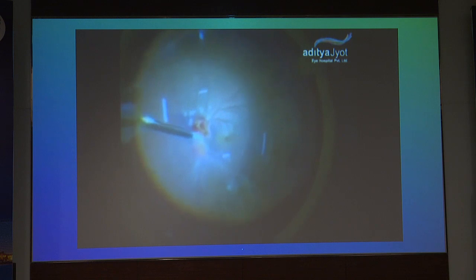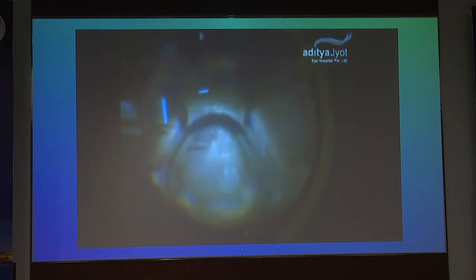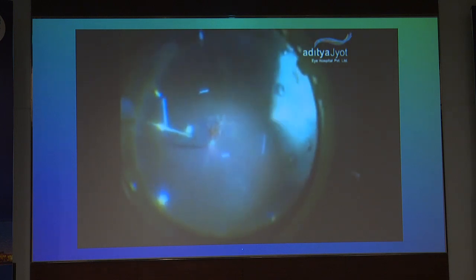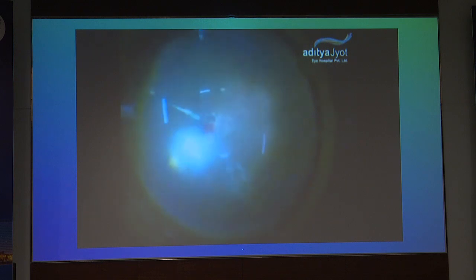And wherever there is a wound, we made a coloboma of the choroid and did a laser, and this patient almost got 6/9 with the aphakic correction, so we can do a secondary implant, which Dr. Tariq, who is here from Kashmir, and his team have done.